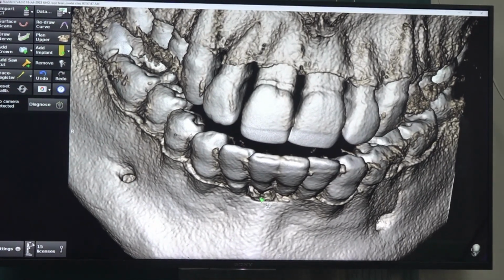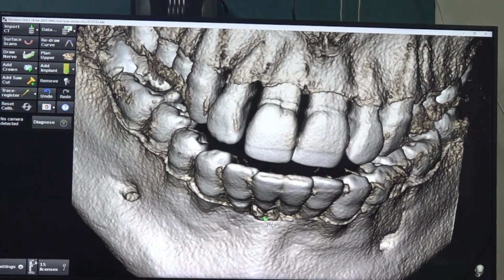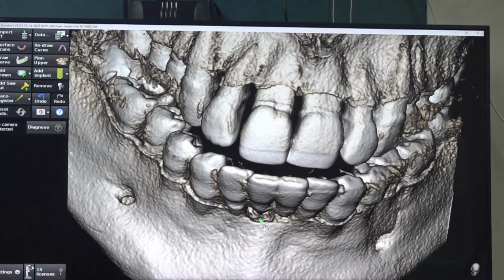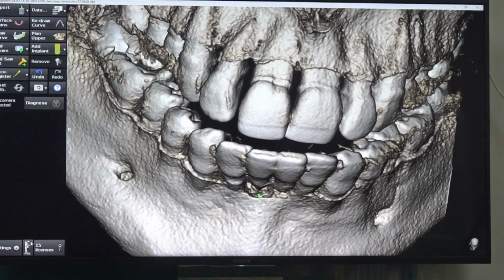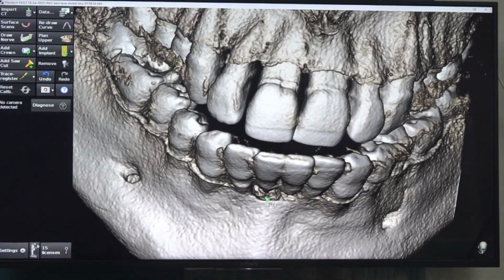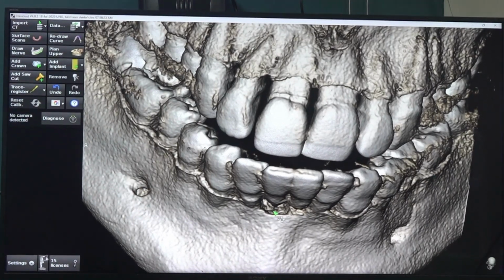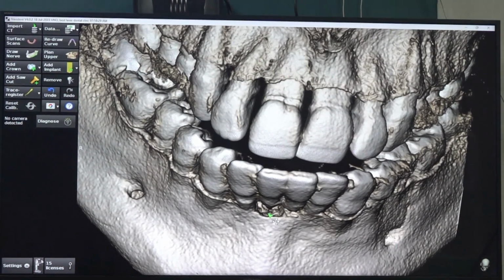If you are replacing 4 incisors, also 2 implants will be enough in most situations. If the space is very wide, then you can think about placing 3 implants. So 4 incisors, 2 implants is actually a risky situation. Both implants should get good stability. If you get good stability of 1 implant and don't get good stability of the other implant, then the entire process is at risk of failure. If you are placing 3 implants, then the risk is less. Even if you don't get good stability of 1 implant, the other 2 implants may give success.